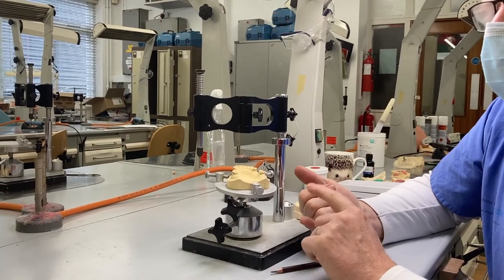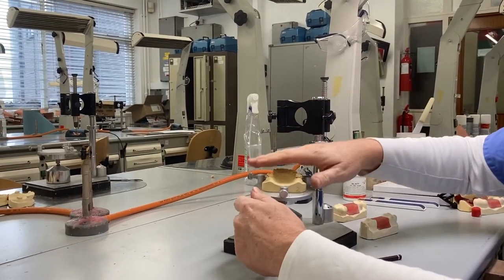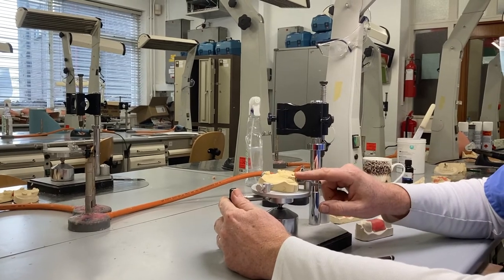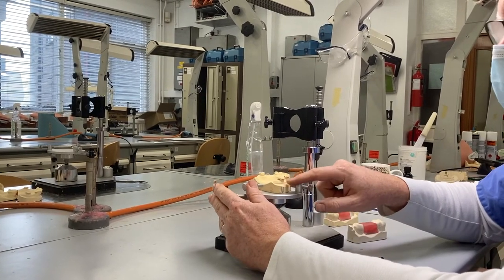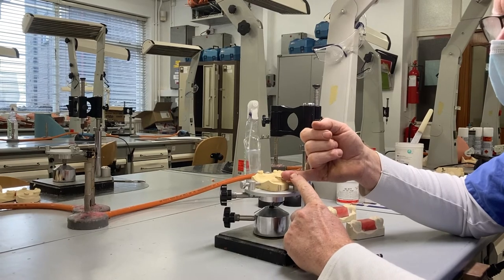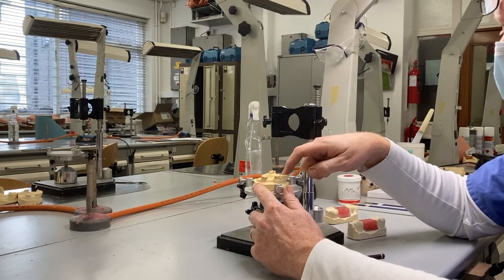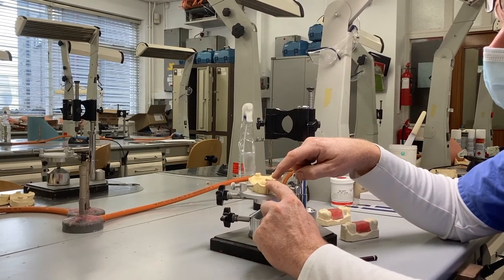Things you need to be able to do after this session: first, you need to be competent at setting up a surveyor and positioning the model relative to the path of displacement — that's parallel to the bench top. Then you need to be able to survey the relevant teeth for the design you're working on, typically the abutment teeth but others as well. You should be able to look at the undercut relative to the path of displacement and discuss the position of clasp tips on each abutment tooth, and discuss the path of insertion with regards to retention — whether it's worthwhile creating a path of insertion to improve retention or for aesthetics in a class four situation.